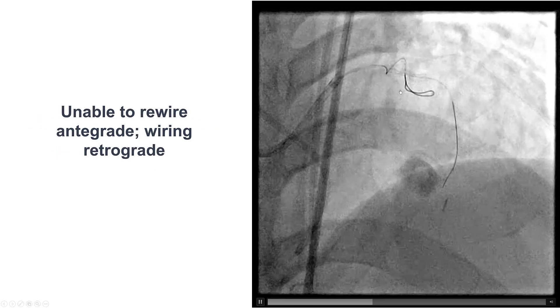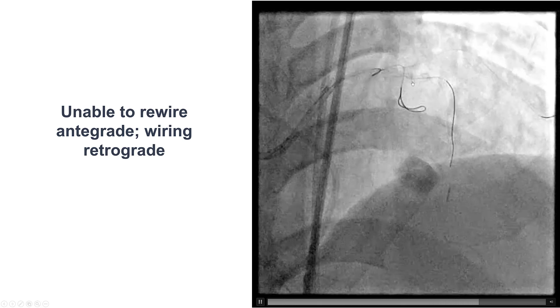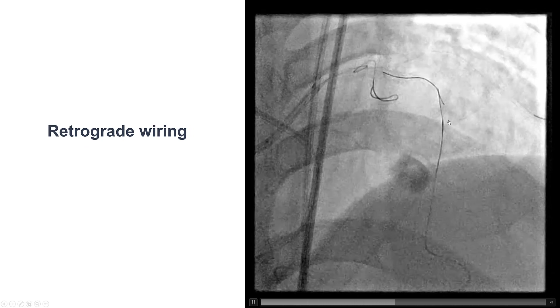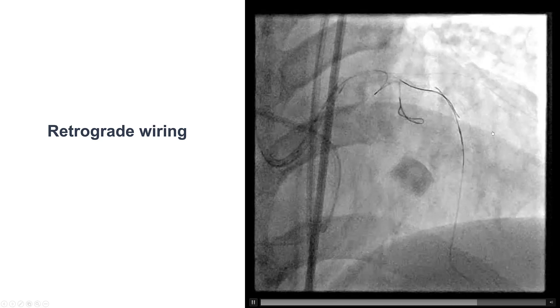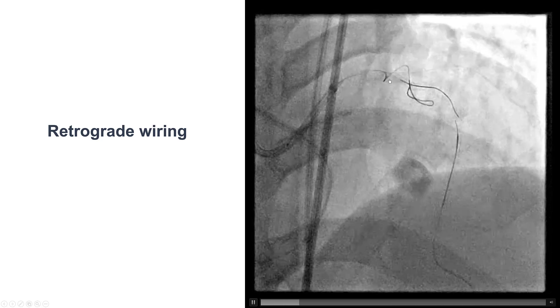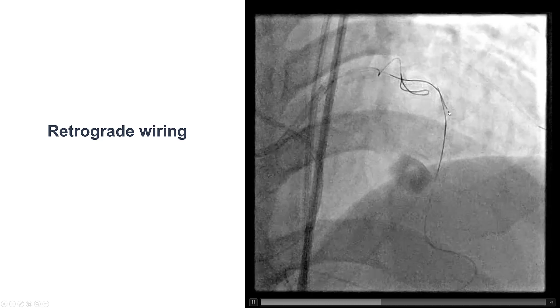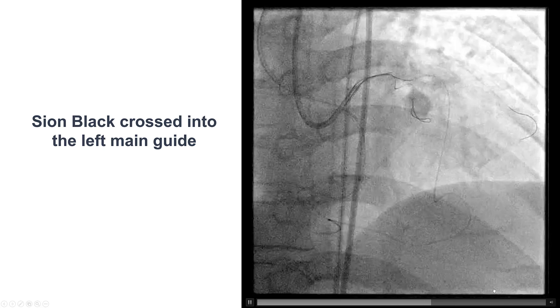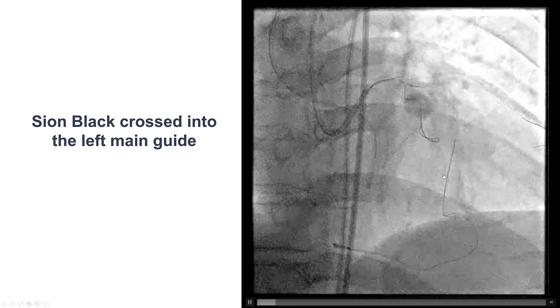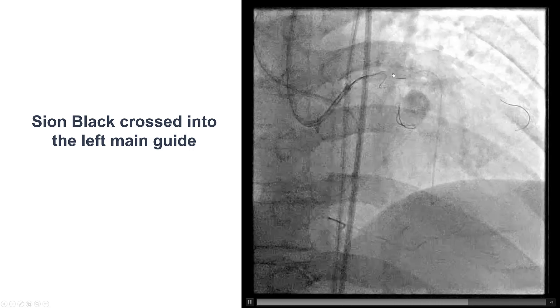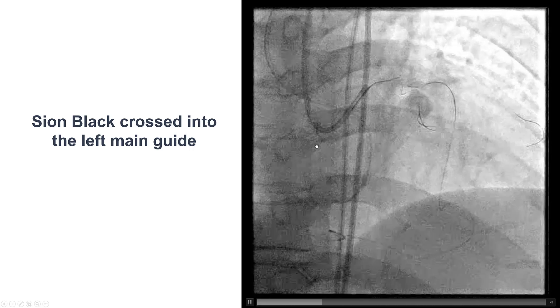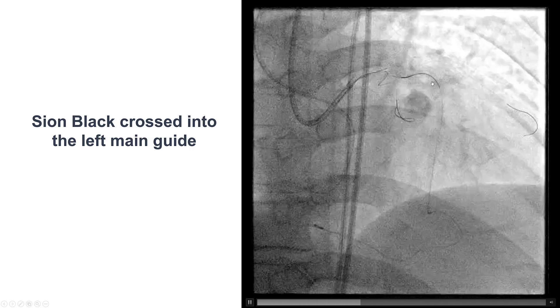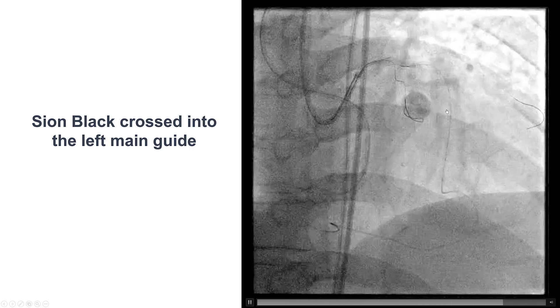Then the problem started. We had a very difficult time advancing a guidewire through the crushed stent. After multiple attempts we decided to use what we had not yet abandoned — the retrograde system. We had advanced an antegrade wire meanwhile which was used to perform our DK crush, but now being unable to advance another wire, we instead advanced a retrograde guidewire through the stent placed into the LAD. This is an example of when rewiring for DK crush cannot be performed in the standard antegrade direction, so we did the wiring in the retrograde direction through a microcatheter.